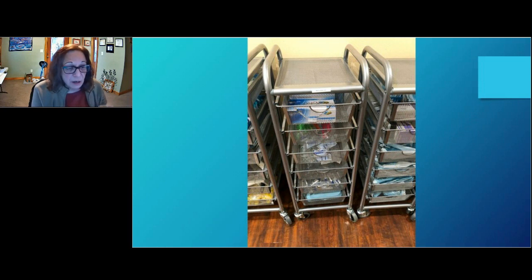It should be stored under wraps, so to speak, in an enclosed space, in a clean area. This isn't a hallway where people walk by all day long, and then when they needed something, they'd just open a drawer, grab it, and run. This was very concerning to me.